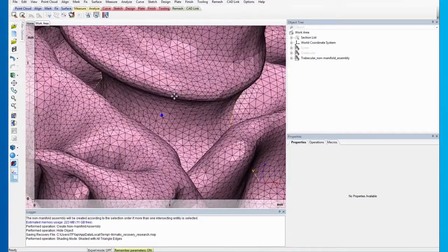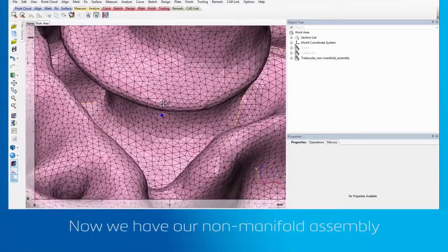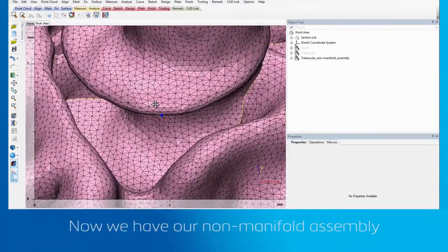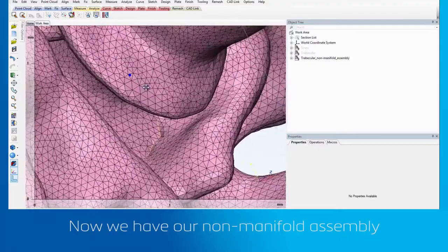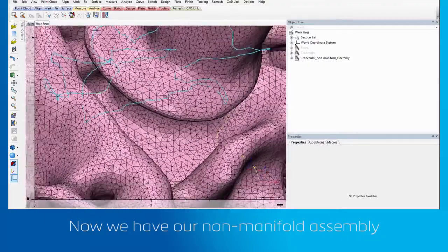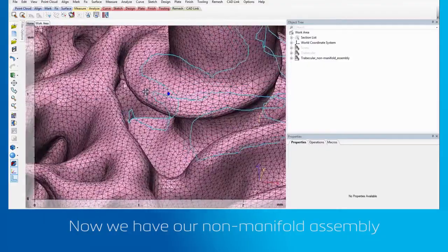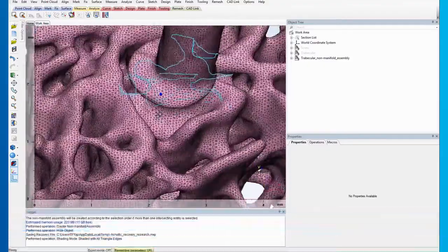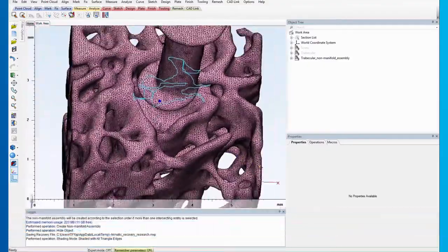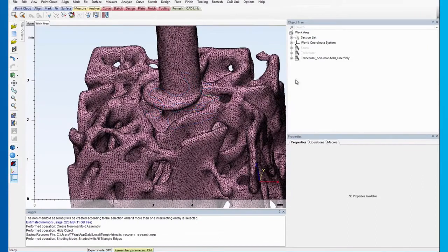Now, we have our non-manifold assembly. Here, you can see that the assembly has a good interface between the screw surface and the trabecular surface.